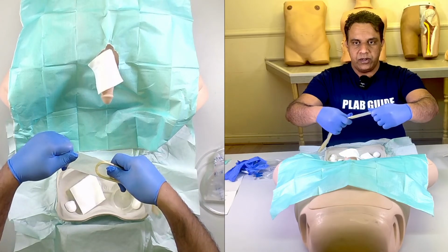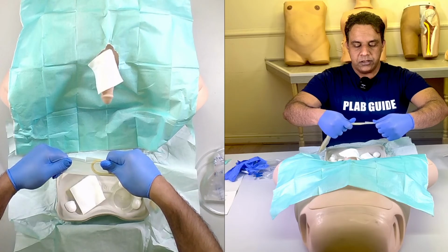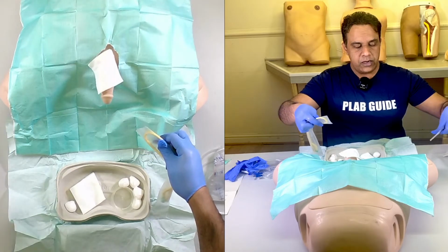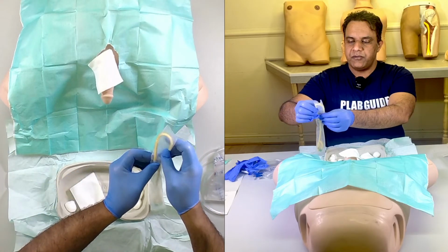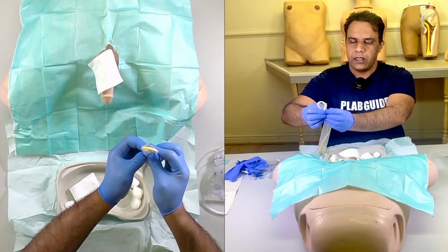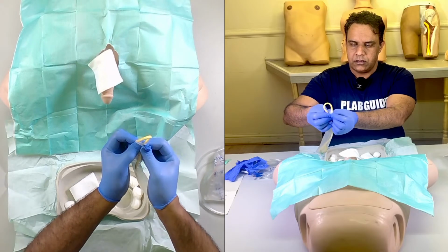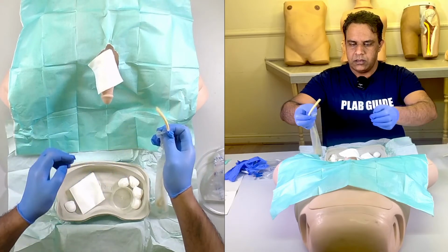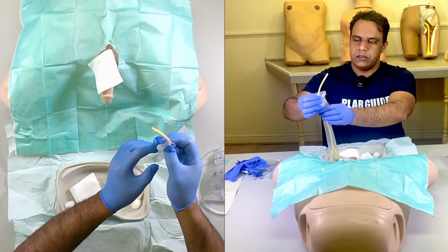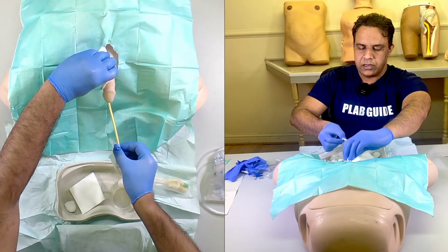Hold it from one end and pull it apart so that it rips off. And now you can see the tip of the catheter comes out. Okay, hold the catheter from the covering outside and insert it.